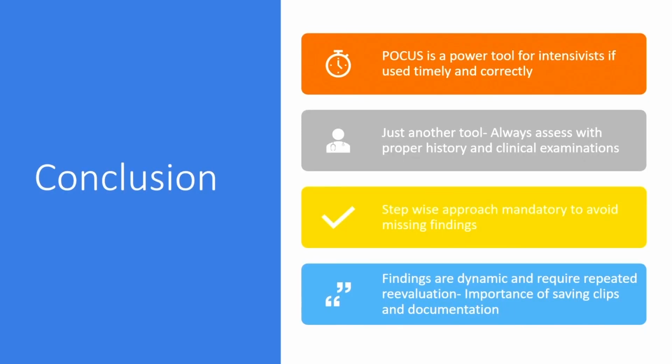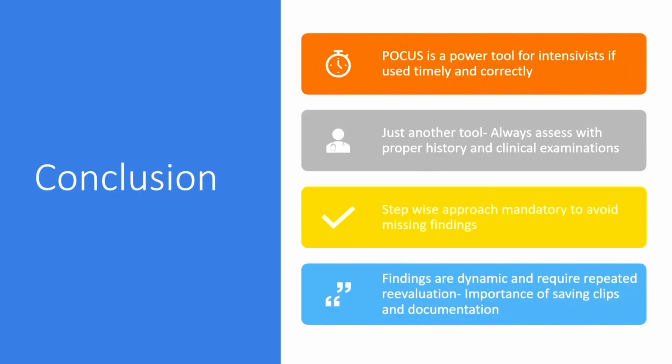So in conclusion, it is a power tool, just another tool. It has to be along with history and clinical examination. A stepwise approach is very mandatory. That's why protocols are made, so you don't tend to miss out certain steps. Do not jump to conclusions by just seeing a few images. Try to complete the entire scan. This is just a part of the puzzle. The whole picture is yet to be seen. So think global, but focus on the regional also.